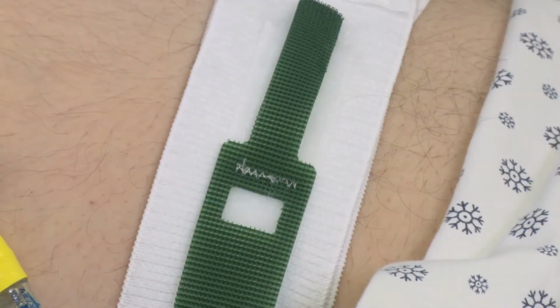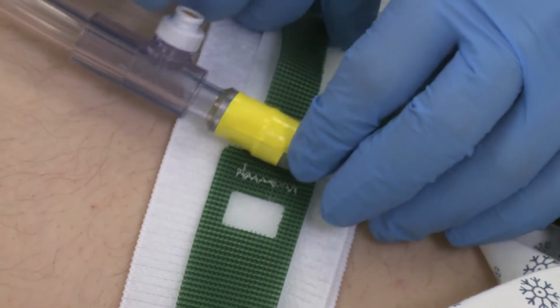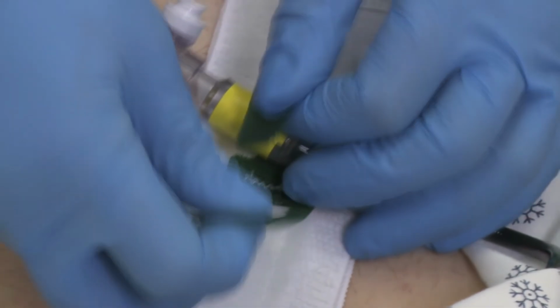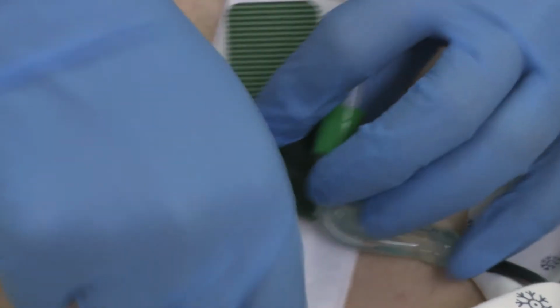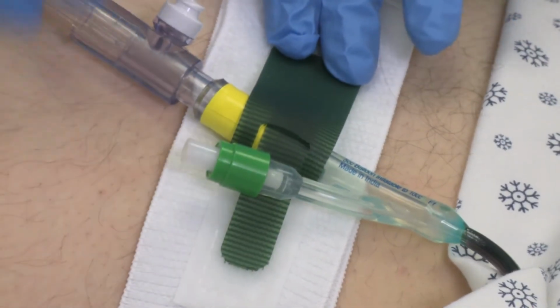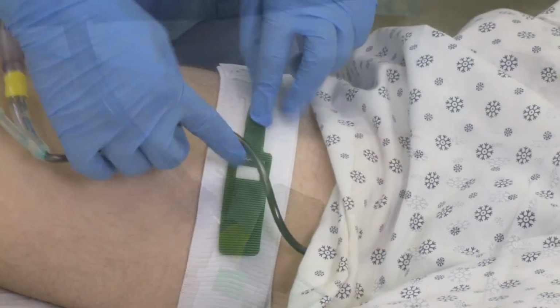To secure the catheter, position the Y port vertically on top of the white stitching between the two green locking tabs. With the catheter in the desired position, insert the narrow green locking tab over the catheter and through the square opening of the other green tab so they overlap. Lock the catheter in position by pulling the green locking tabs in opposite directions and securing them to the base. Proper compression is achieved when two fingers fit snugly under the band.